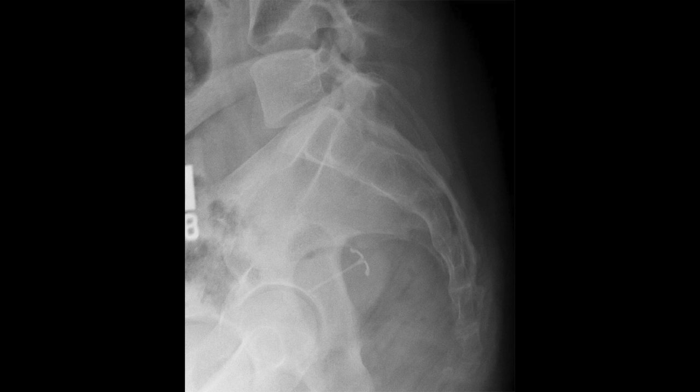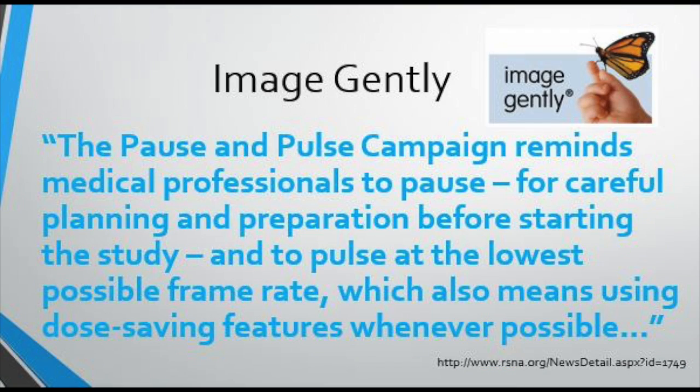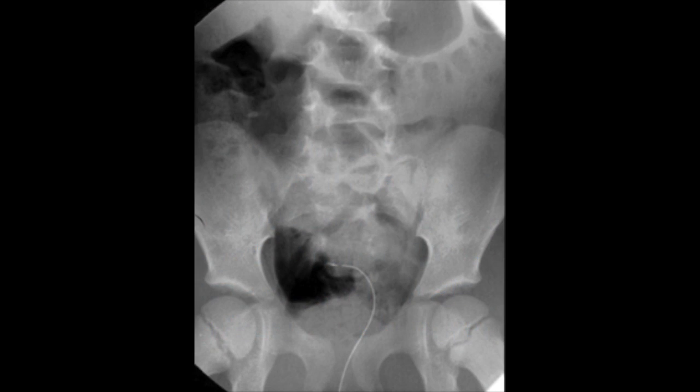Selective use of a lateral image may be helpful to evaluate the sacrum if there is a concern for sacral anomalies. We have a professional and ethical responsibility to keep ALARA in mind, and in many cases, fluoroscopic image capture is sufficient. However, a digitally acquired spot image or radiograph may be preferable in specific clinical situations needing superior spatial resolution.